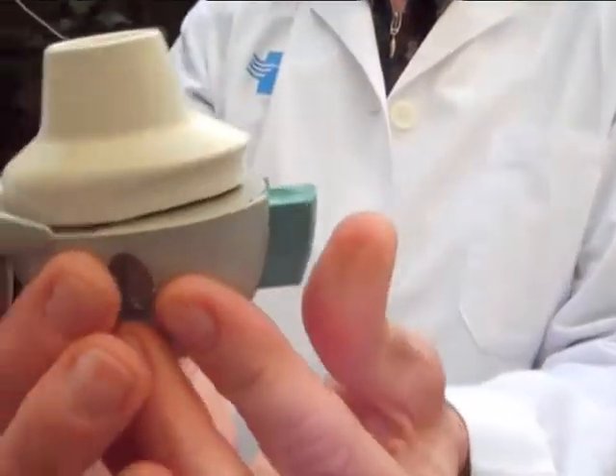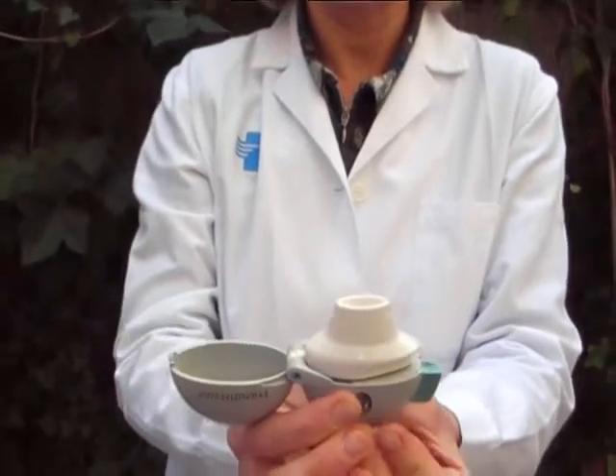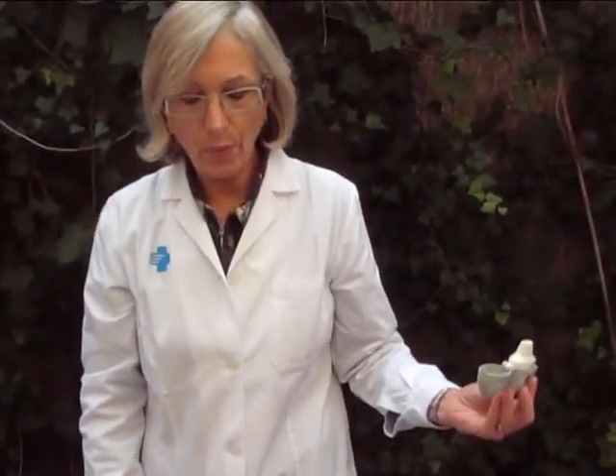Puncture the capsule by pressing the green buttons once. When you do this, you should hear a click. Breathe out gently while turning your head away from the inhaler.